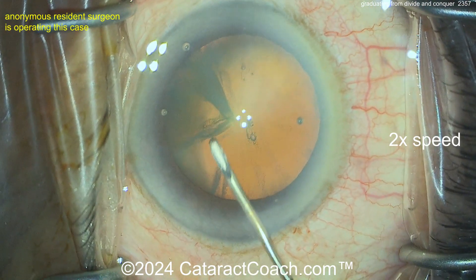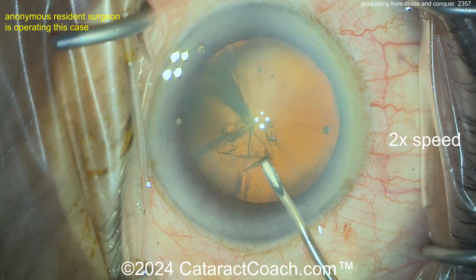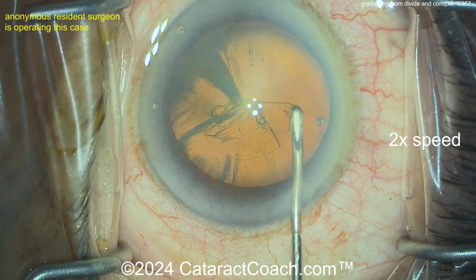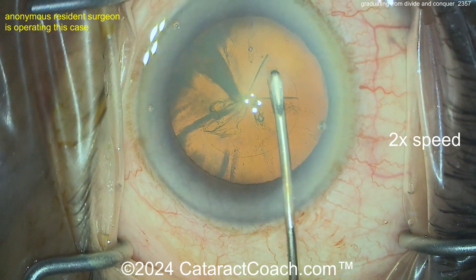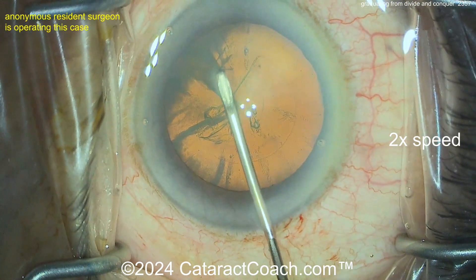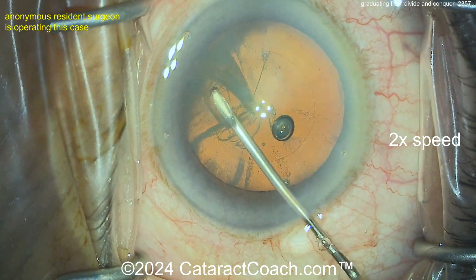The system's going in. We sped the video up to about two times normal speed and that looks pretty good — get that turned over. Look at that, that's a good technique. You've got good hands for sure. Certainly for case 300 — beautiful, you're right where you need to be.